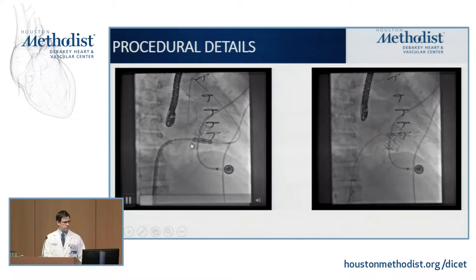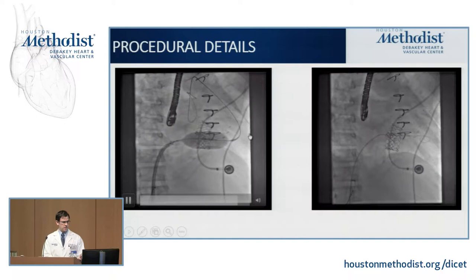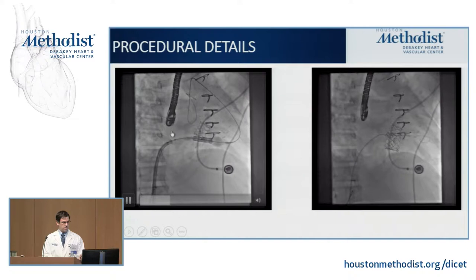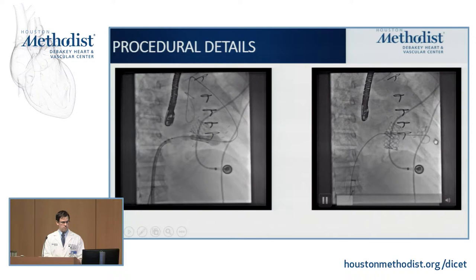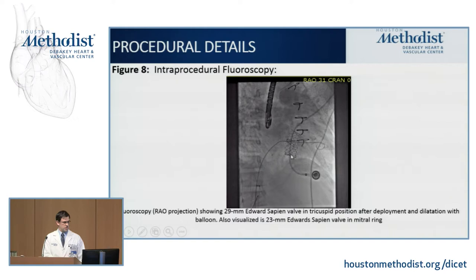The pacemaker lead had to be pulled back to avoid trapping it, which meant this valve had to be deployed without rapid ventricular pacing. A slow, controlled deployment was used to ensure appropriate and stable positioning throughout. Post-procedural imaging showed no residual tricuspid regurgitation and good forward flow, though with notably poor RV function. A post-procedural fluoroscopy image shows the double-barrel valves in position.